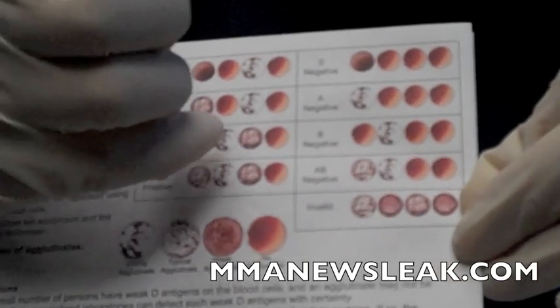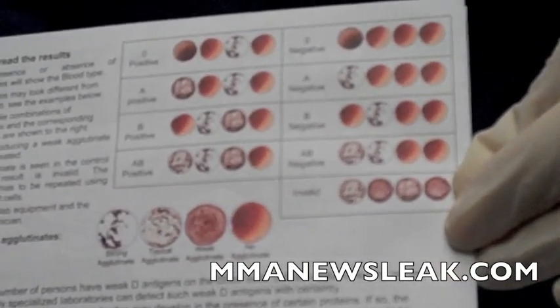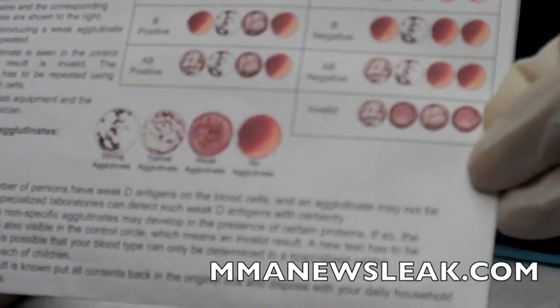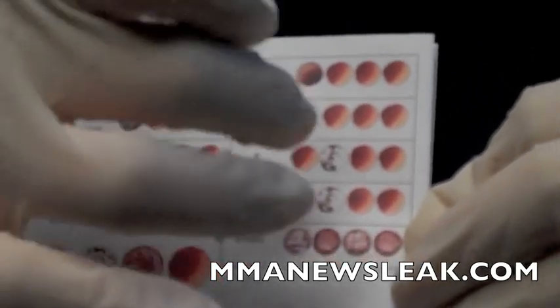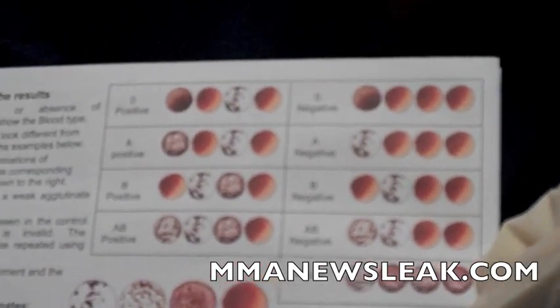B clumps up for the anti-B column. If they're positive, the third column is going to clump up as well. And then AB blood type, because they have anti-A and anti-B working against it, is going to have all three clump up if you're AB positive. And if you're AB negative, you're going to have just the two — anti-A and anti-B — clump up, destroying the red blood cells.